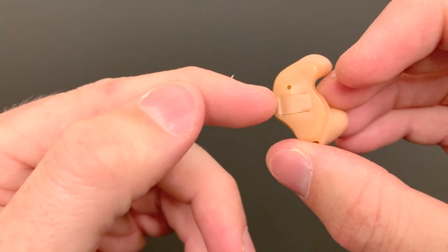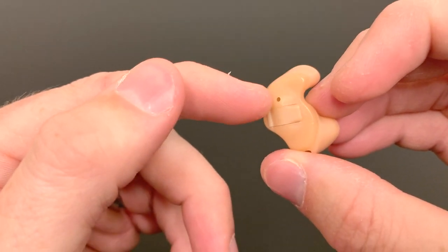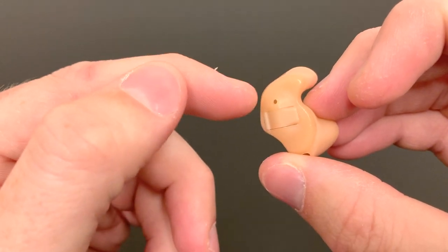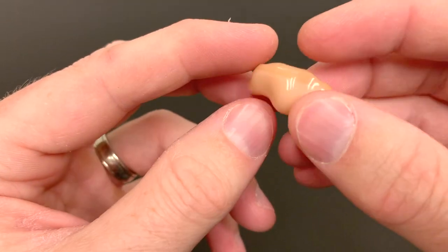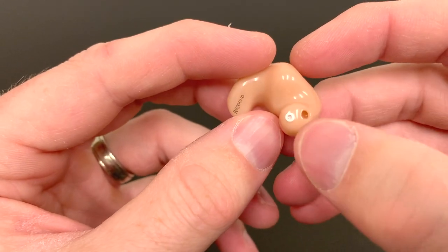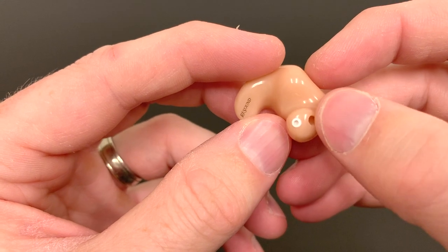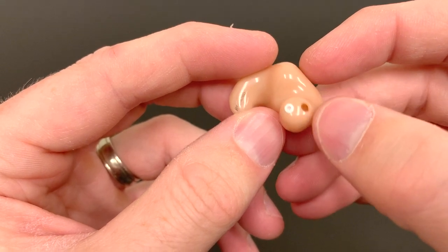So on this style of hearing aid, again, your parts are the battery door is here, microphones are usually here on the front face. This is called the face plate here on the front face of it. And then we have the receiver with the wax guard here, and you also may have the vent tube here.